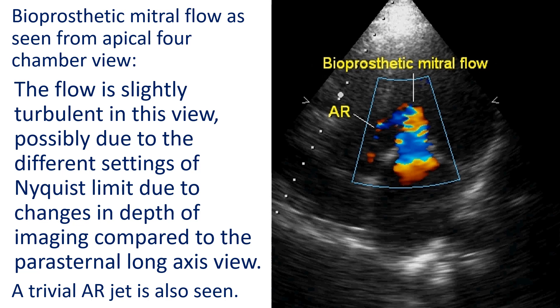Bioprosthetic mitral flow as seen from the apical 4-chamber view. The flow is slightly turbulent in this view, possibly due to the different settings of the Nyquist limit due to changes in depth of imaging compared to the parasternal long axis view. A trivial aortic regurgitation jet is also seen.